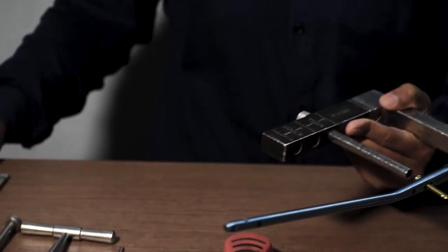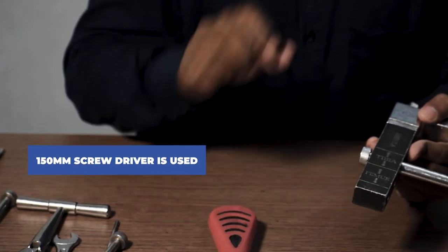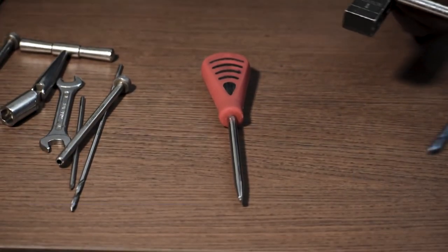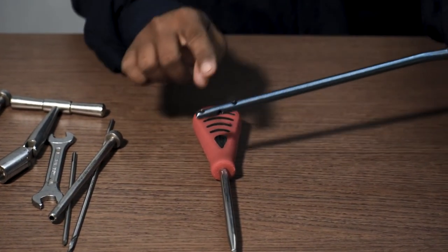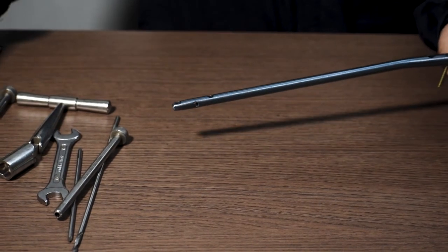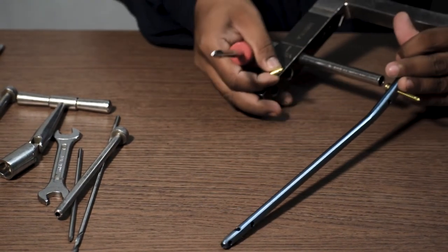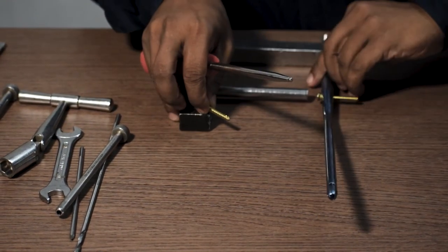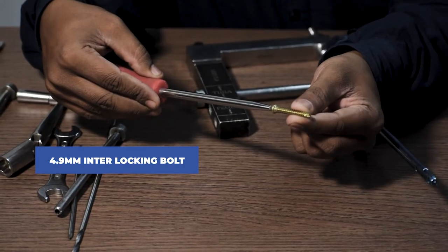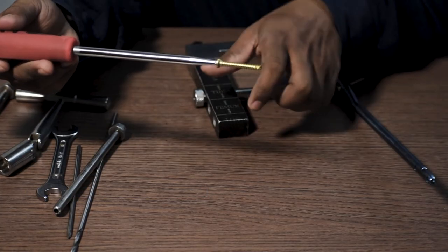In the same way, 150 mm screwdriver is used to fix the interlocking bolt in the distal part of the nail. A 4.9 mm interlocking bolt is used here as well and it is fixed freehand.